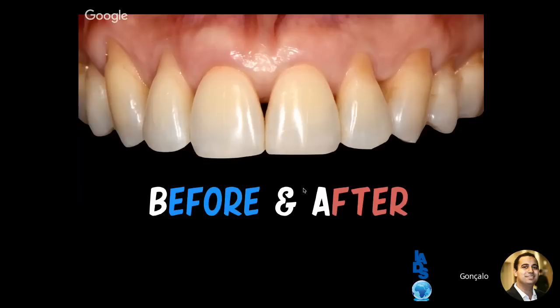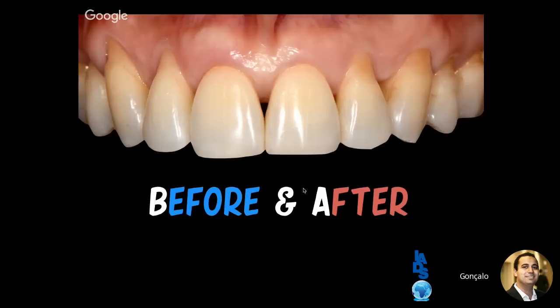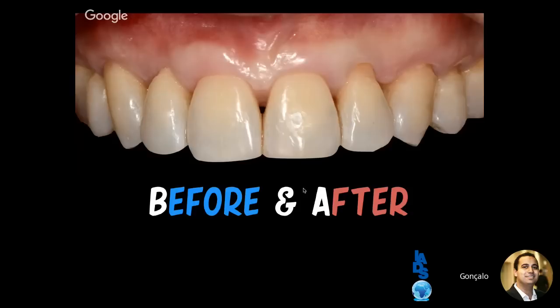So if you take a look at the before, and if you take a look at the 3 months after, you can see that, of course, we didn't have complete root coverage, but you can see how much thicker the tissue is compared to what it was initially. And if you take a look at the post-op, we were able to have partial root coverage. The tissue looks healthy, much thicker. So I'm pretty sure it will be stable and we will be able to stop the further progression of the gingival recessions that we were having.